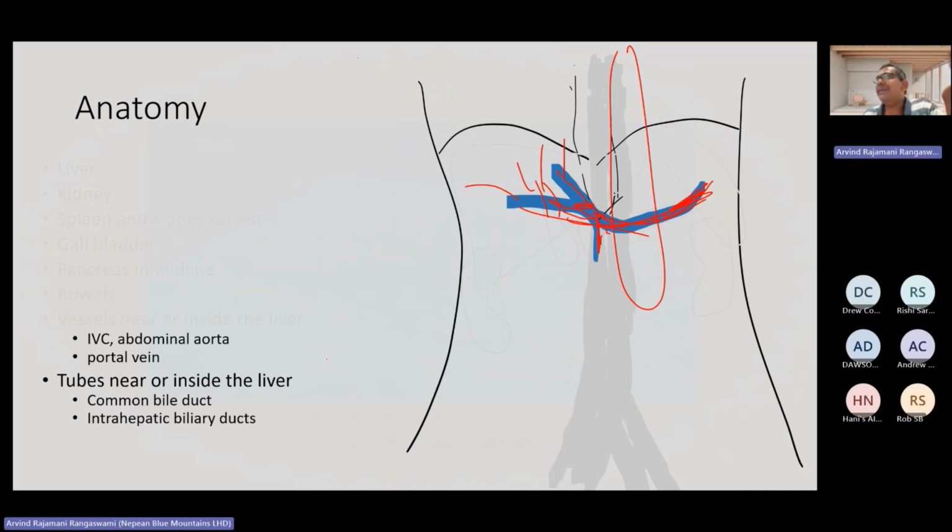If you think about it, before you started doing cardiac echo, if I asked you about the internal anatomy of the heart, and even now, even after doing cardiac echo, the three-dimensional visualization of the heart is something that we haven't learned in MBBS. We haven't really conceptualized it or visualized it. And therefore, it's extremely difficult for us to understand various parts of the interatrial septum, for example, why the heart doesn't actually have a posterior wall, it only has an anterior wall, etc.